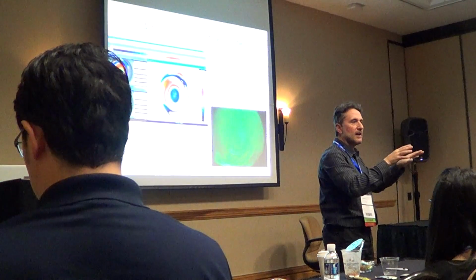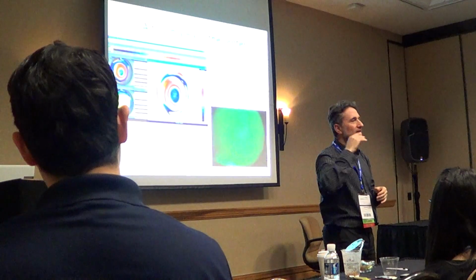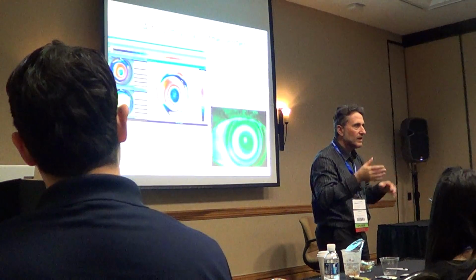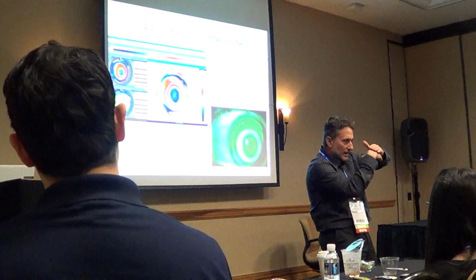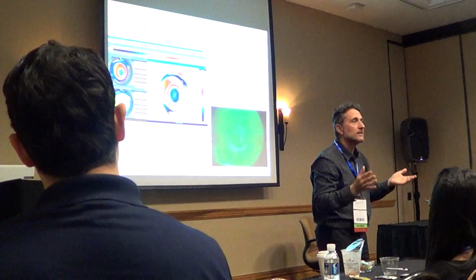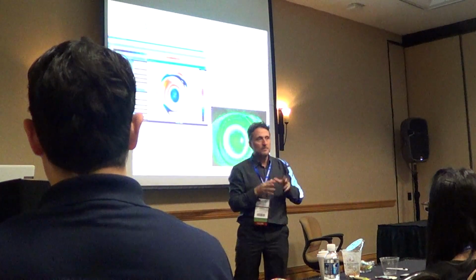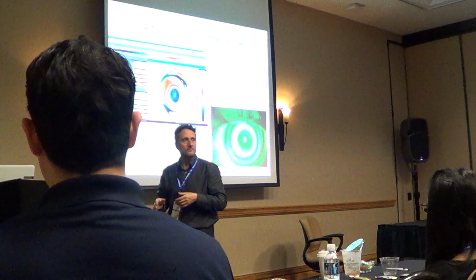You have a central island. Try to flatten the fit. The central island will not improve. It will be worse. If you steepen the fit and you create separation, not touching the apical zone, the central island will disappear. That's it. Try it. It's not me. Try it. Okay, but I'm 100% confident.